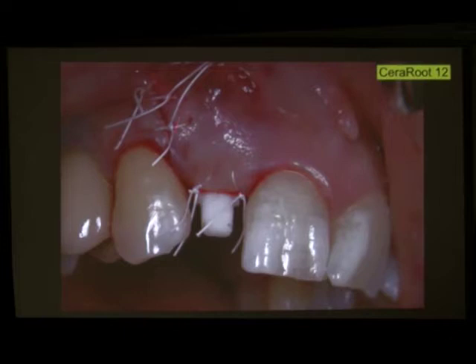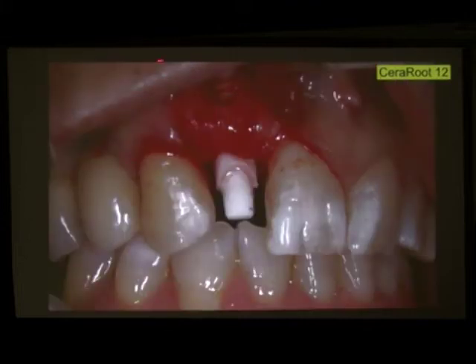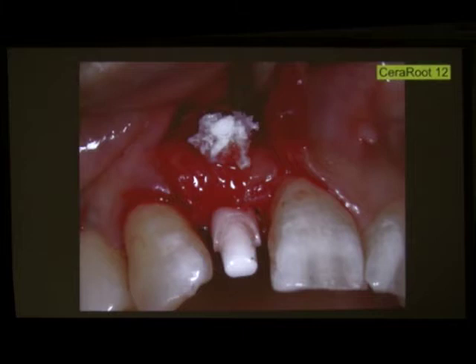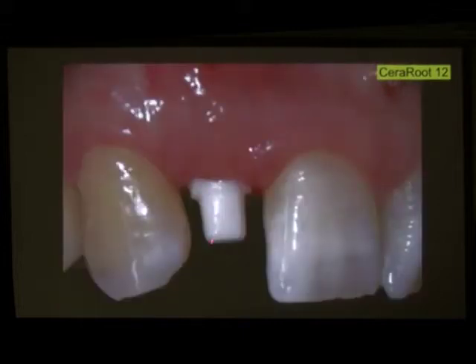This is the type of flap that we do when we have a defect. We don't make two incisions. We make an incision first distal to the lesion, and then we open the gum mesially. And if we have enough visibility, just by doing one vertical incision, we have plenty. We like to work with Gore-Tex sutures. These sutures can stay in the mouth for a long time. They can stay 1 or 2 months, and they do not produce any type of swelling. And this is 4 months post-op.